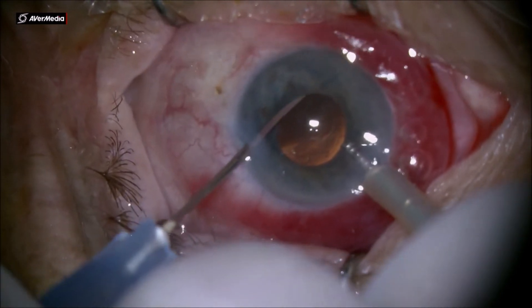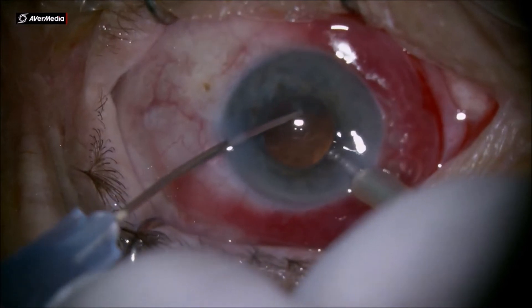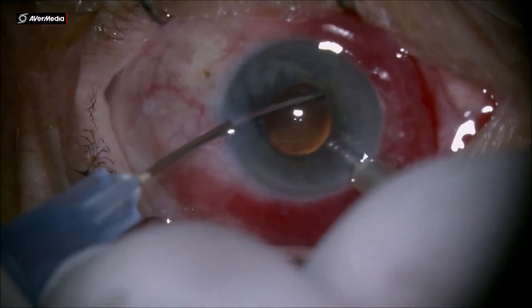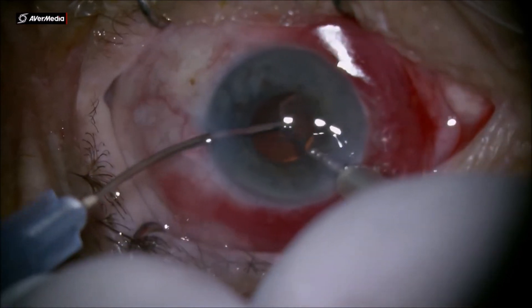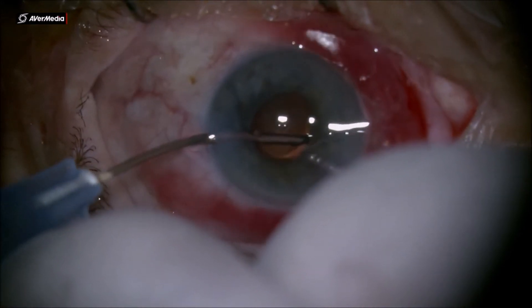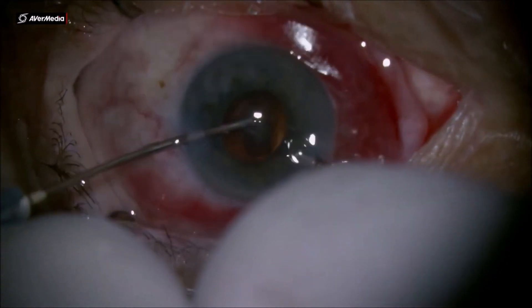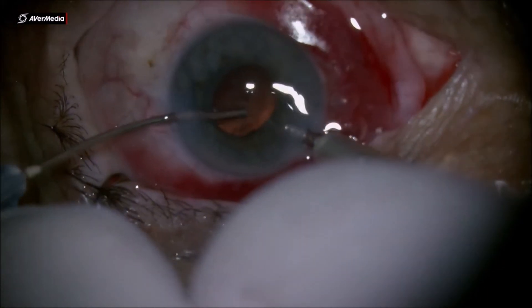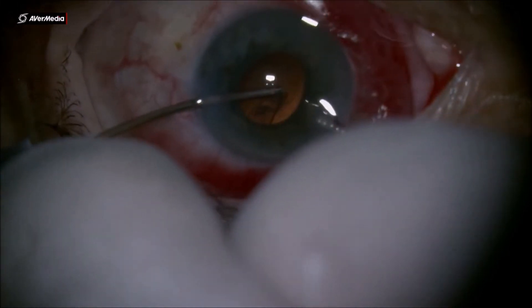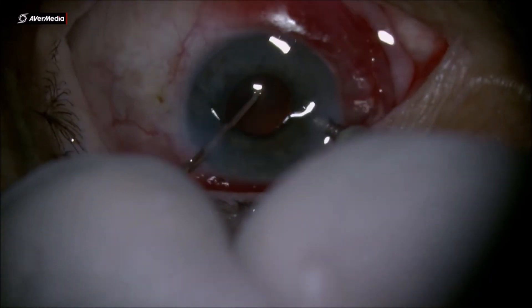Aspirating the cortex — especially in glaucoma patients you really need to make sure the entire cortex in the bag is aspirated. At the end of the cleanup you may choose to check with the Sinski hook or with the Mishev chopper and make sure the bag is clean after cortical removal. Since any viscoelastic or cortical remnants left in the bag or anterior chamber will start an inflammatory process post-op, which you really don't need in these glaucoma patients.